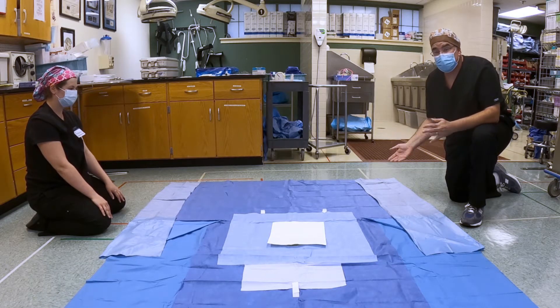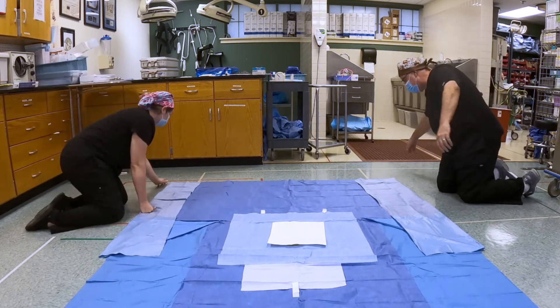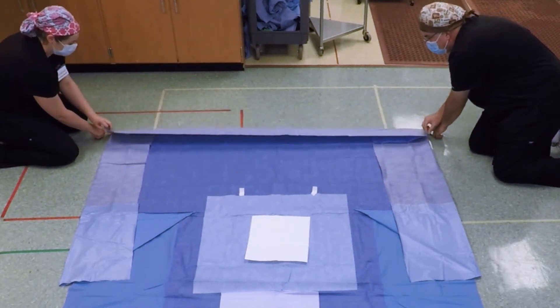Remember how we did the half sheet? We sort of did the fan folding — the accordion fold. We're going to do exactly the same thing here. We're going to find this first crease, which is right here; it happens to want to come up. We're just going to take this first piece and fold it over.